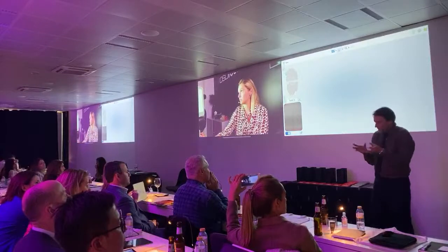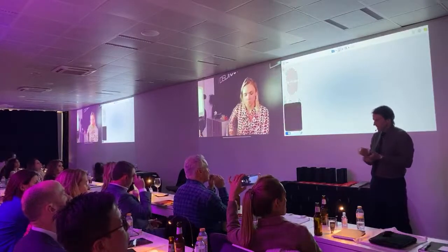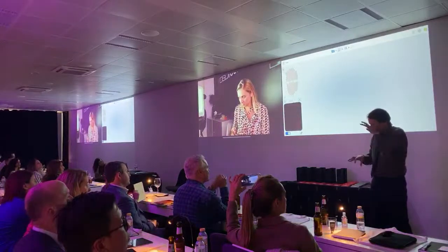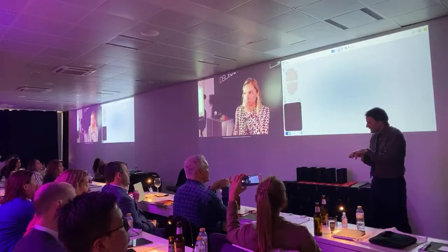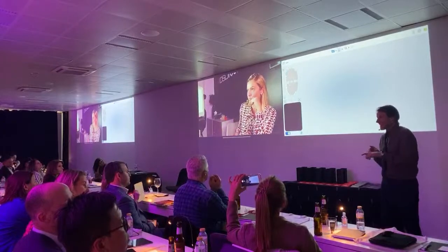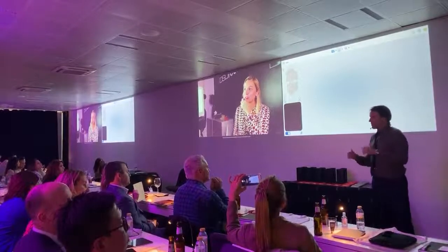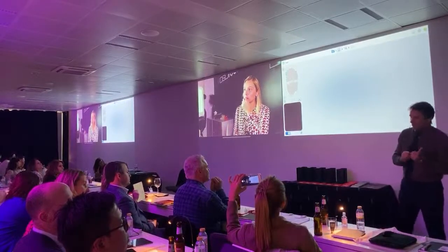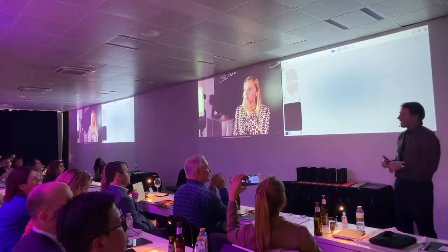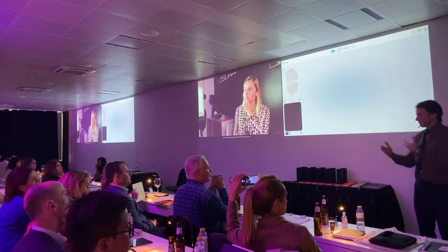But as things change in the mouth, even the soft tissues, the palate, whatever, you scan on the same day, right before prep and right after prep. And these two files, the soft tissues will be perfectly overlapped, okay? Now, since you scanned before prep, you have the teeth identical to the other scan that the DSD design was done on. So you overlap the pre-prep over the design and the post-prep over the pre-prep, and then you take the pre-prep and throw it in the trash, and you have the prep over the design. Make sense?